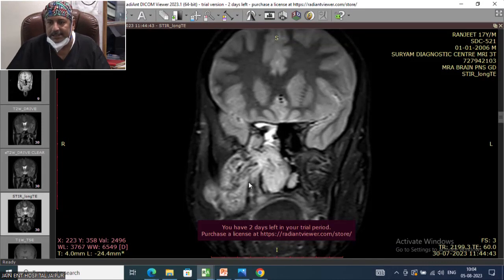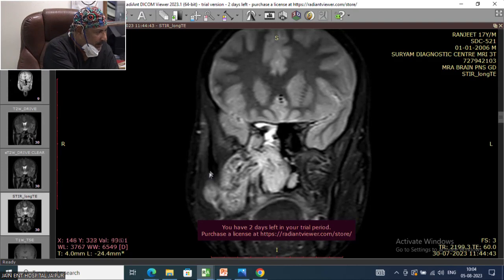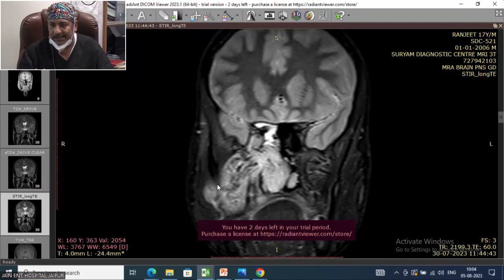That's how it gives hemorrhages. So the goal in this surgery, my principal tool, my man of the match, is going to be the coagulator. As the majority of the vascularity is towards the surface everywhere, we'll use the coagulator in a sequential fashion. Everywhere the tumor is exposed, we'll use the coagulator. That's how we'll minimize the bleeding.